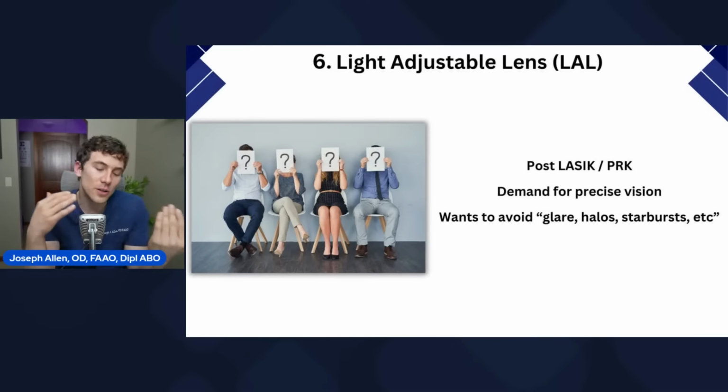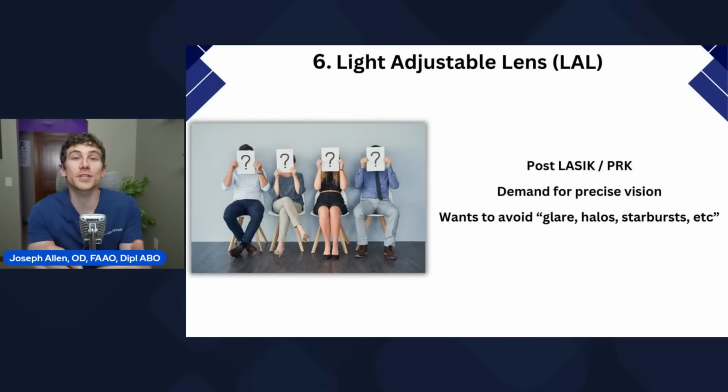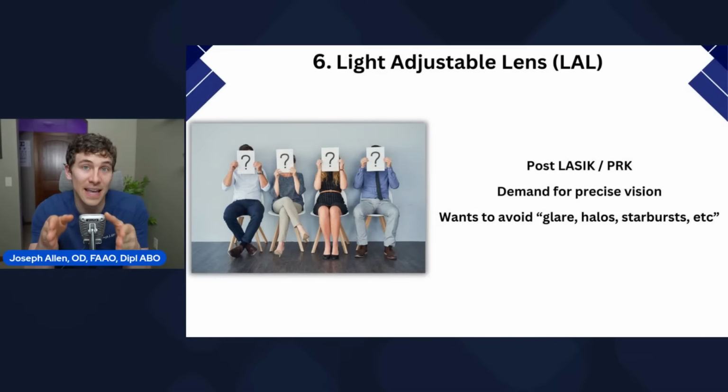And I think also, just from a personality standpoint, if you're somebody who knows that you need to see as sharp as possible. I've had some sharpshooters and military personnel who can tell if their vision is even just a hair off. They demand 20/20, if not better vision at all times. If that sounds like you, then again, the light adjustable lens may give you the best chance of getting that precise vision.